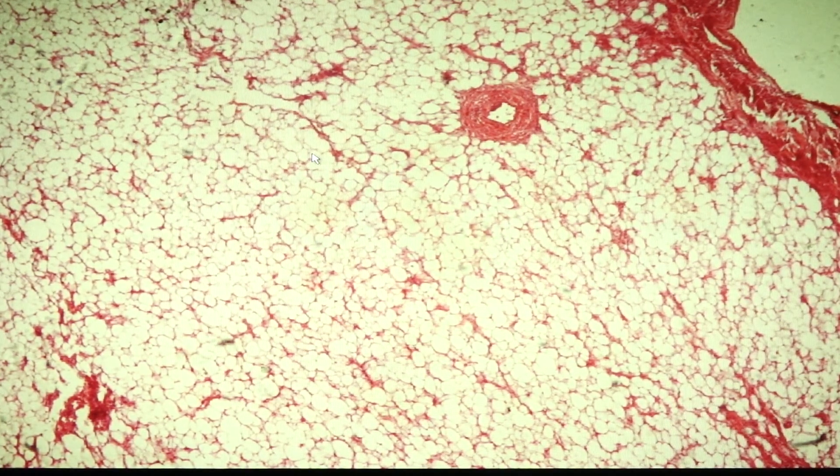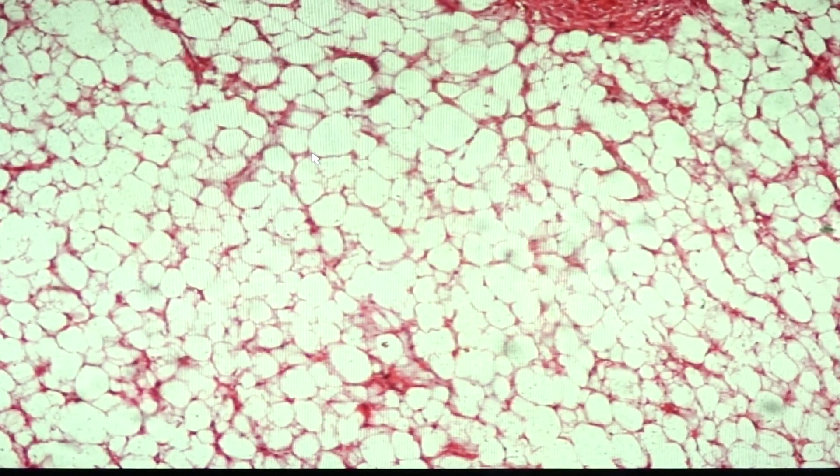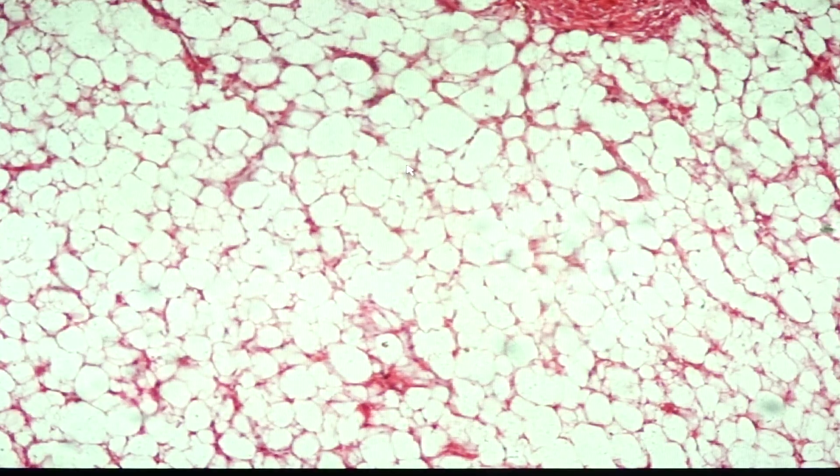Next we go to slide 95. Slide 95 is a benign tumor called lipoma. The origin of this particular tumor would be from fat or adipose tissue. It's very difficult to differentiate from the subcutaneous tissue. It is identified to be located at the subcuties of extremities or the trunk. Histologically, what we would see would be mature adipocytes with abundant clear cytoplasm and the nuclei located at the periphery.